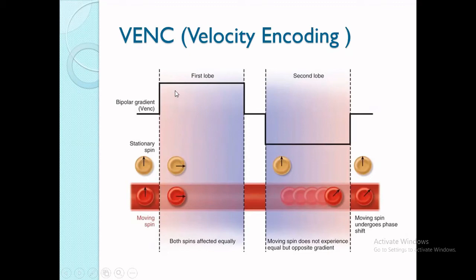The time and the amplitude are very, very important. You can't apply half of it in the next one. You will have to apply the same amplitude and the same time, or distance. So both of them should have equal and opposite values.